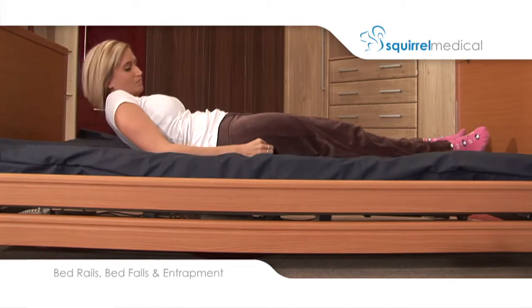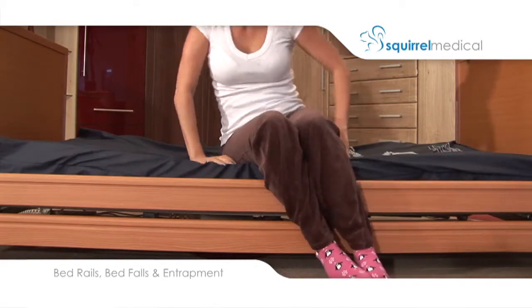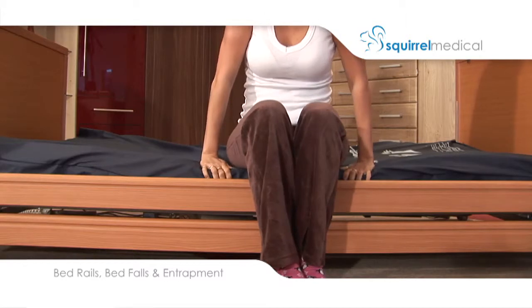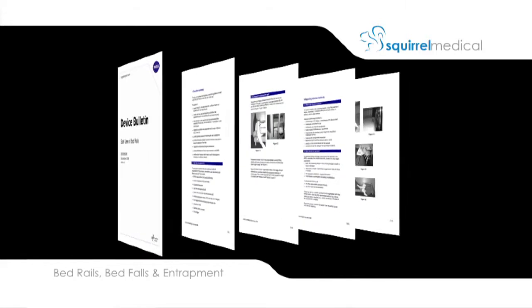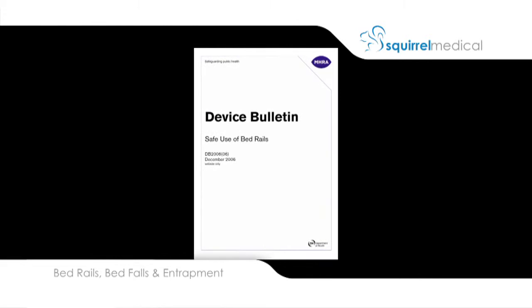Many care providers now use low-height nursing beds which comply with BS-EN 1970. These can be effective so long as they are used with a suitable low-profile mattress and in line with MHRA, CQC and HSE guidance. In particular, the safe use of bed rails and managing medical devices.